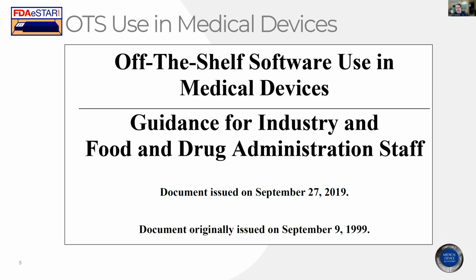We've done it. We've helped other companies do this. So you can do it, but you don't have to switch over to Linux for everything or some proprietary system that you develop yourself. You can use open source software. You can use off-the-shelf software such as Microsoft Windows for the operating system.